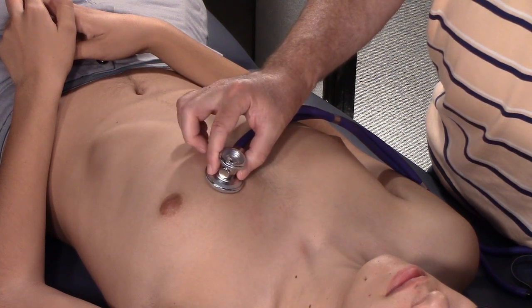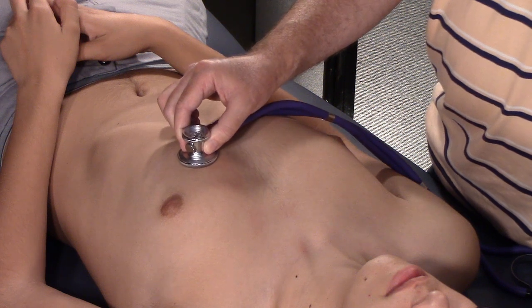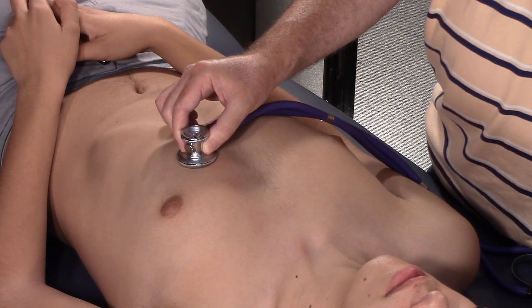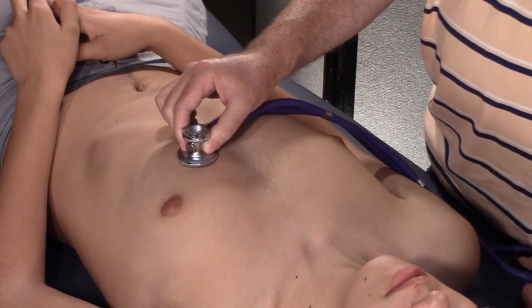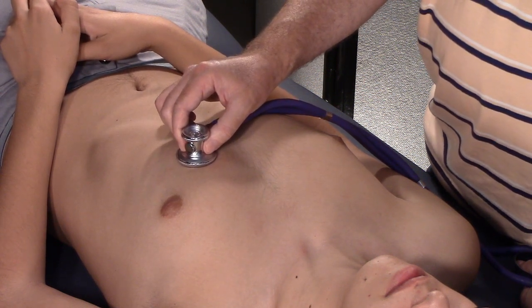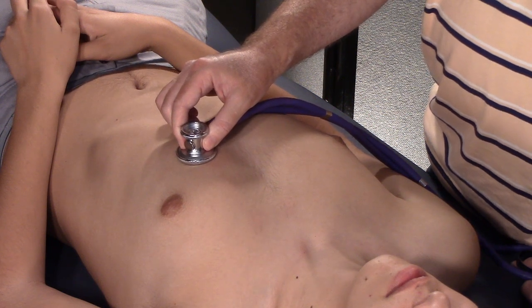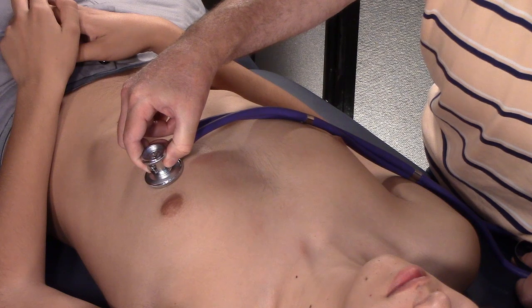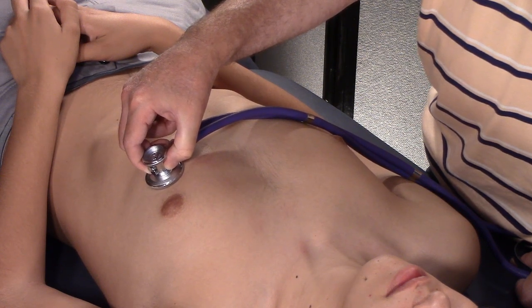From Erb's point, go down in your mind's eye to the fifth intercostal space — it's not the fourth, so make a slightly bigger jump. Fifth intercostal space left sternal border — that's the tricuspid valve. Another mnemonic: 'All pigs eat too much.' Now the big jump — stay in the fifth intercostal space but move to the midclavicular line, just inside or a little below the nipple. That's the mitral valve — M for 'much.'